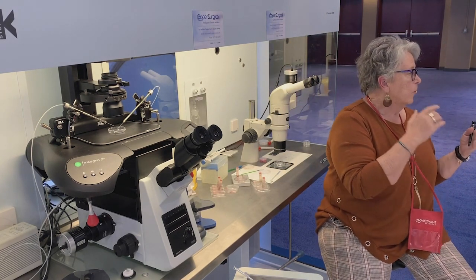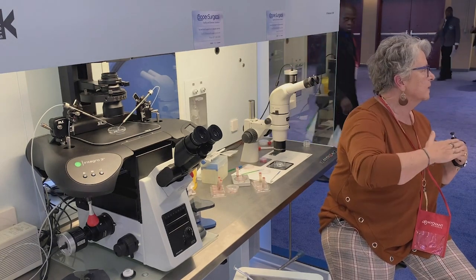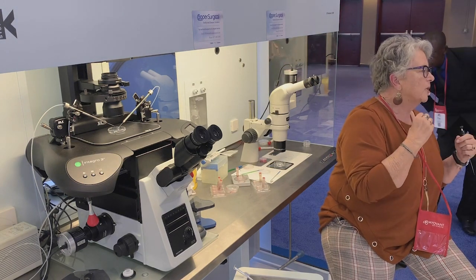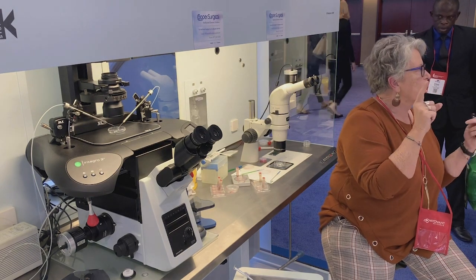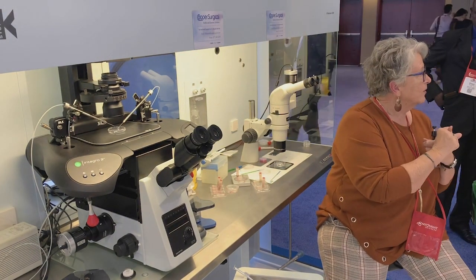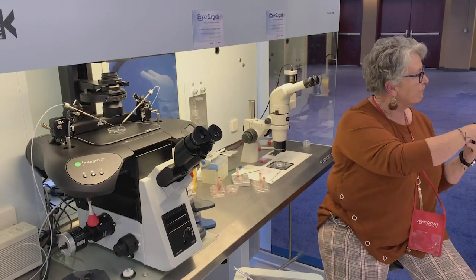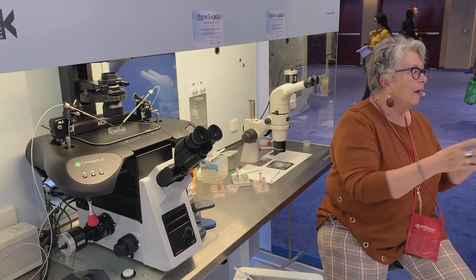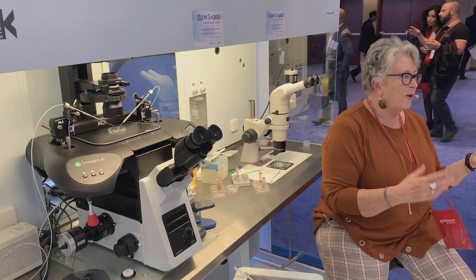We had one time where embryos were shipped four blocks in San Francisco, from one program four blocks away from us to us. And by the time they got there, every single device, who shall remain nameless, it wasn't a VitriGuard, but they were all out of their goblets and all the caps had come off the devices in four blocks. So I don't know what the shipper was doing. Maybe they rolled it down the hill for four blocks. I don't know.